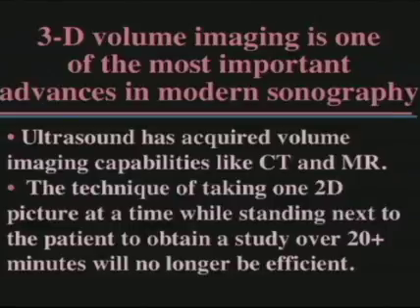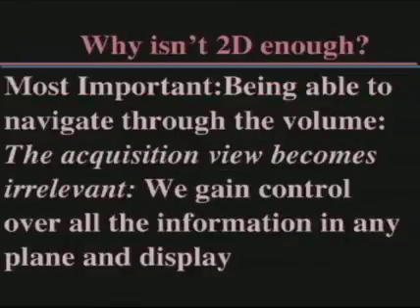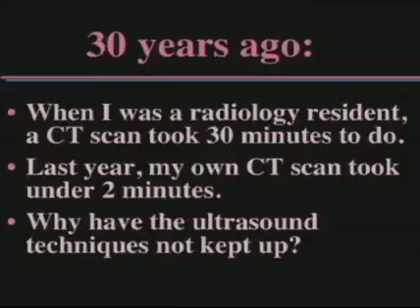Because when you think about it, the technique of taking one 2D image at a time, which is a very thin slice, while standing next to the patient for over 20 minutes, is really no longer feasible. 2D really is not enough anymore. We need to have an entire volume that we can navigate through and reconstruct any plane that we want within that acquisition, and gain control over all of the planes and all of the anatomy and the displays.